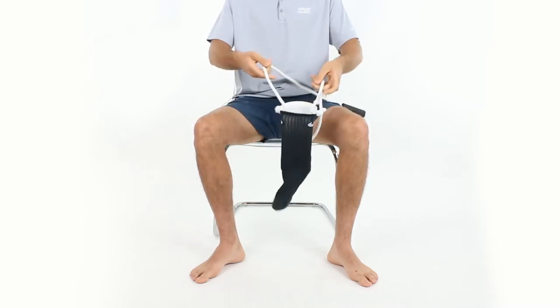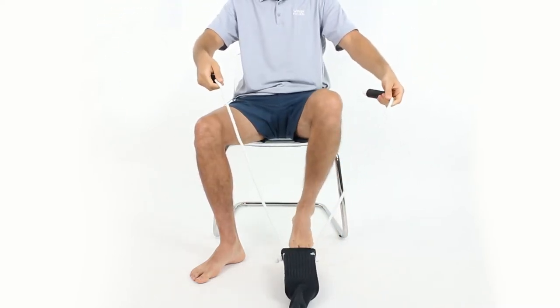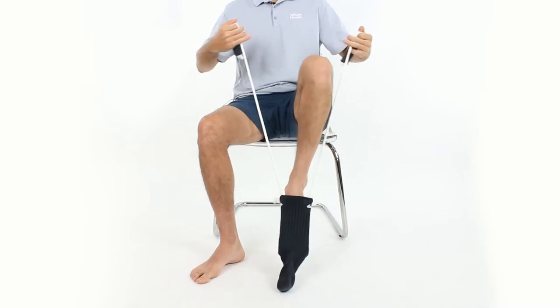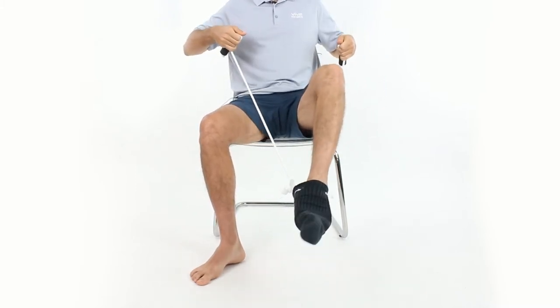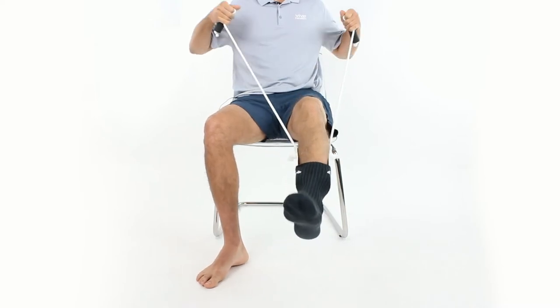And then you're going to drop it, so you don't have to bend over at all. You're just looking to get your foot right inside that channel. And once you do, you can pull, and you're going to feel that resistance from the pad, and you can line it up. And that actually went on perfect.